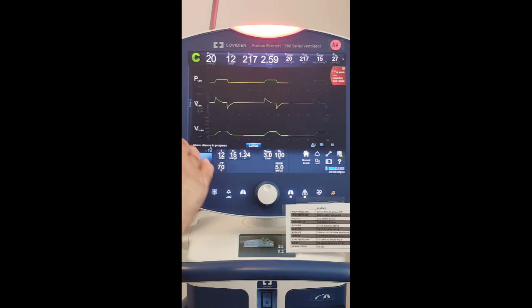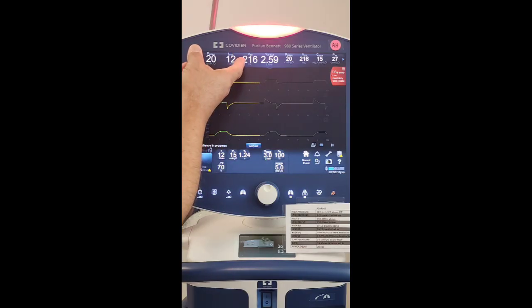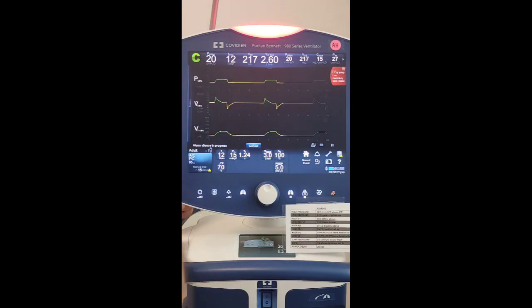It's the same way as when we first set it up on AC/VC. We're going to do the formula using 6 liters per minute, okay? If I'm only ventilating right now at 217, I'm going to take a guess, I don't have my calculator with me, but if I had 6,000 milliliters, I'm dividing 216 into 6,000, and I'm thinking it's going to be 30?